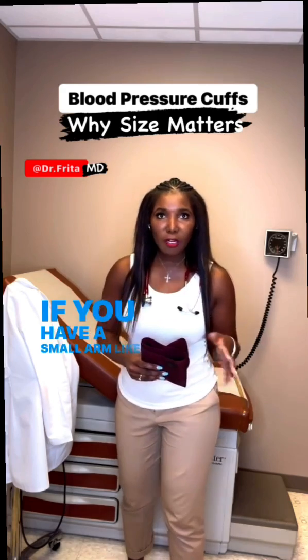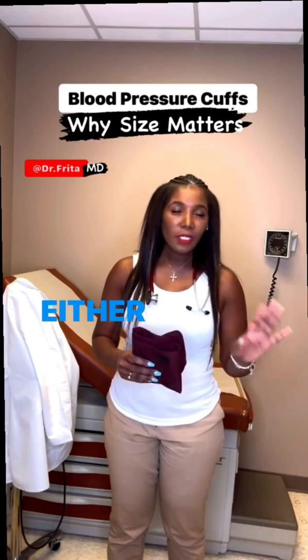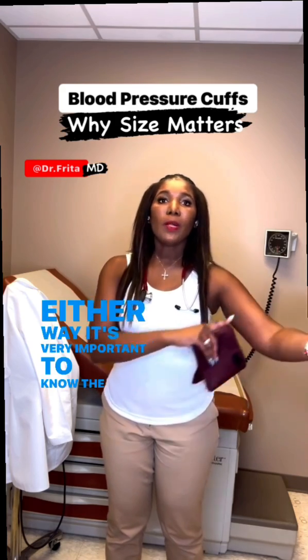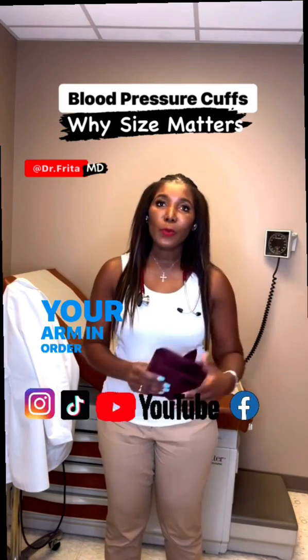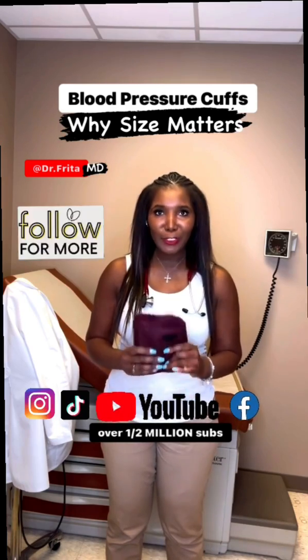If you have a small arm — less than nine and a half inches — then you may actually need a children's cuff. Either way, it's very important to know the circumference of your arm in order to have the proper blood pressure cuff size and accurate blood pressure measurements.